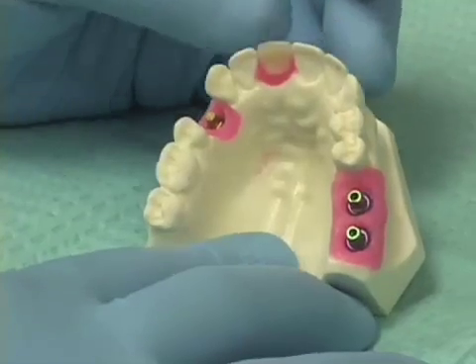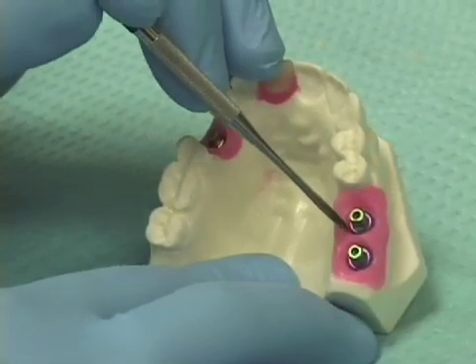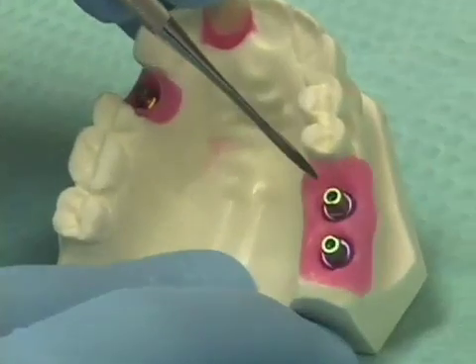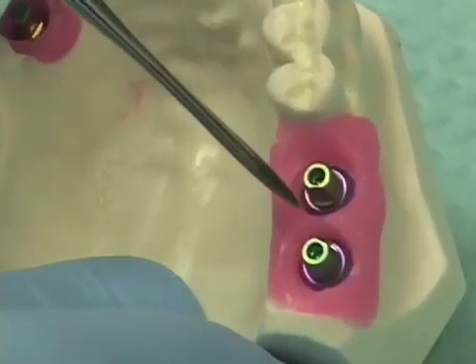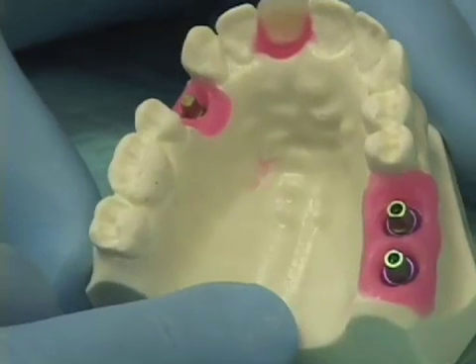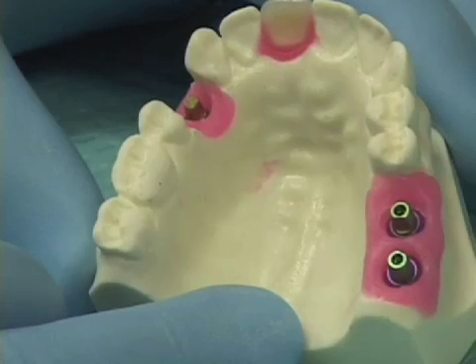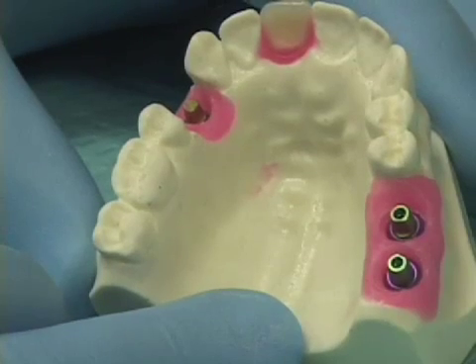One of the things that a custom provisional restoration will do is to help sculpt or shape the emergence profile aspect of the gingiva surrounding our implant. There are a couple of things we can have done ahead of time before the patient ever comes in that makes the fabrication of the provisional restorations much easier.